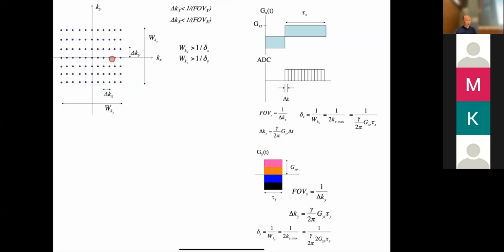So remember, you're going out to this part in k-space. You're not doing the whole k-space. So the job of this one is just to go halfway out in k-space, right? And I think the other problem, most people got that right, so I don't think we need to go over that. So any questions, either in person or online?